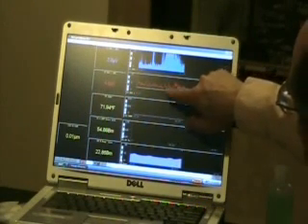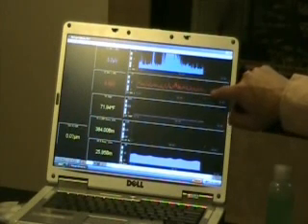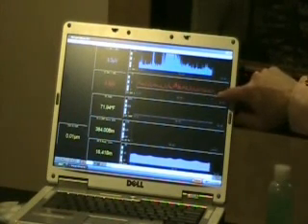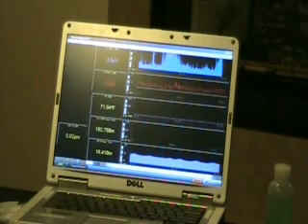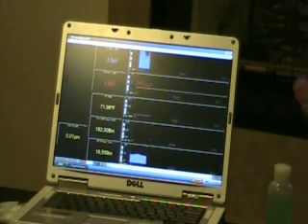Okay, so we're getting good recordings. What we're looking for here is noise, any kind of an artifact that would look like something coming from the lights. Or a bad signal. The signal breaking up, it would just look like static. It would go and it's not, so we're doing fine.